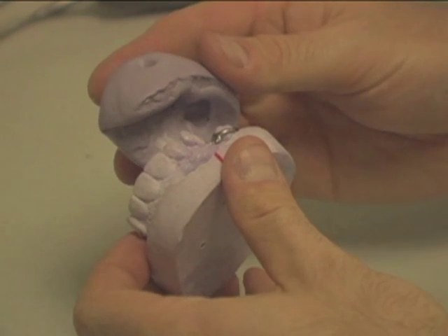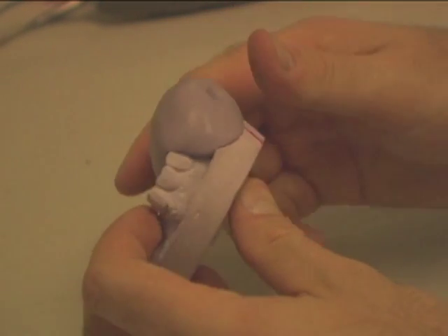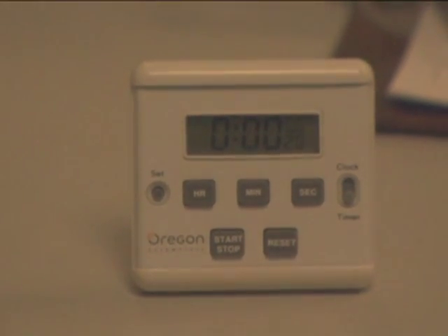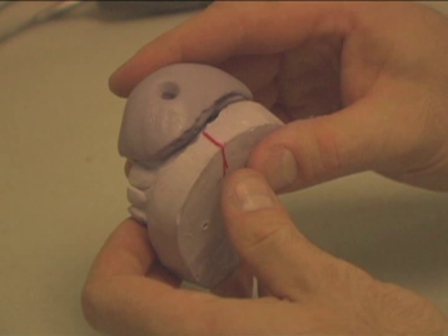Preheat. After removing all wax, place the matrix back on the model and place the assembly in a heating oven. Once the timer beeps, have your model matrix assembly out of the oven.